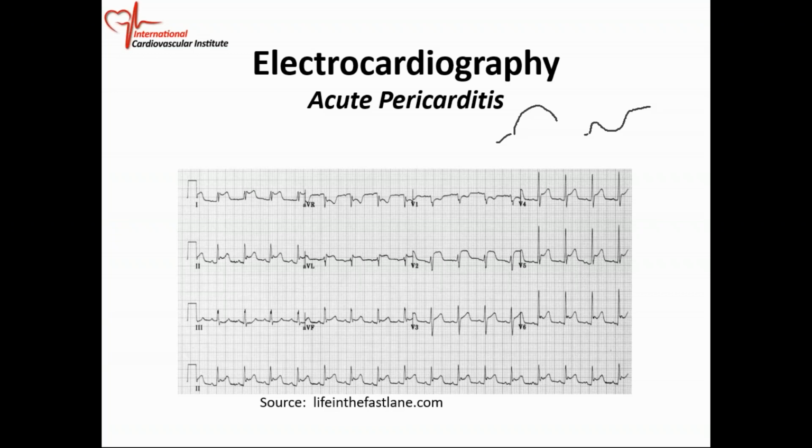They may have a white cell count when you do the blood test. They might have a temperature. They behave different. And it might be a young patient, whatever. But you have this widespread ST segment elevation. You don't usually get a heart attack involving the whole heart. So that should tip you off. And then the patient usually presents with sinus tachycardia.